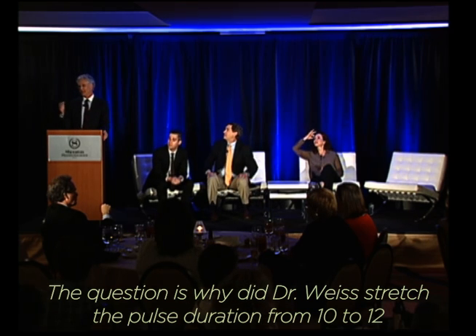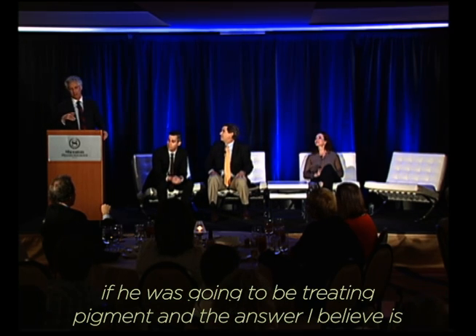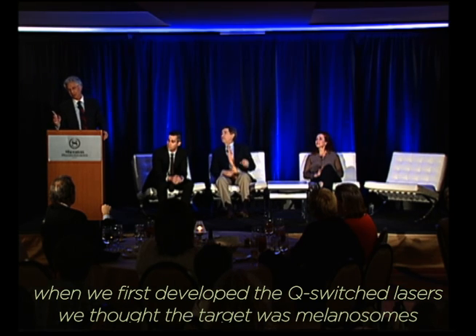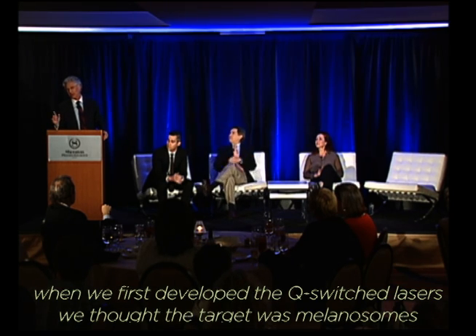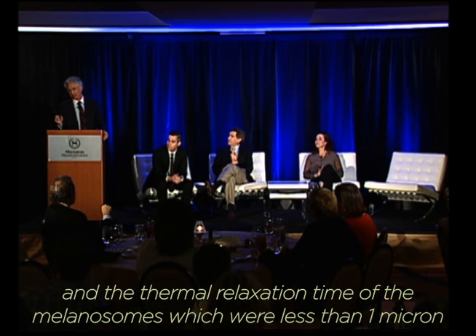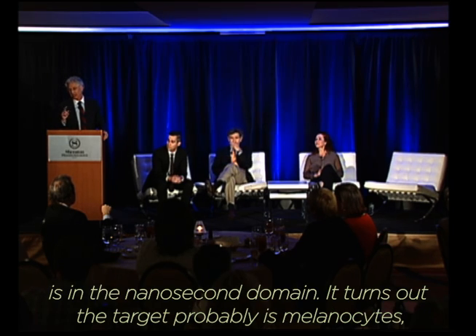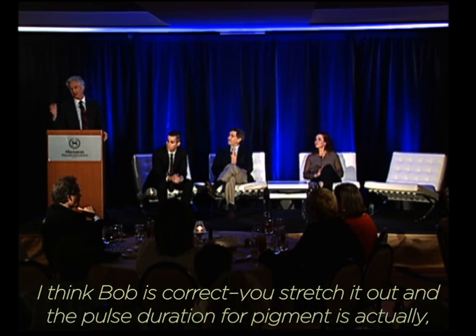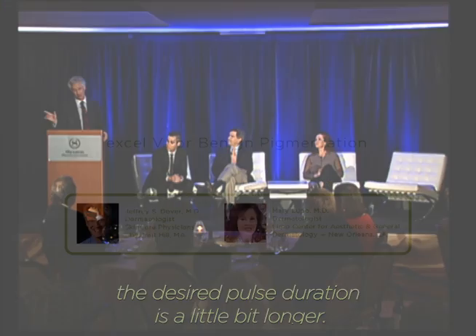The question is, why did Dr. Weiss stretch the pulse duration from 10 to 12 if he was treating pigment? And the answer, I believe, is when we first developed the Q-switch lasers, we thought the target was melanosomes. And the thermal relaxation time of melanosomes, which are less than 1 micron, is in the nanosecond domain. It turns out the target probably is melanocytes, which are much bigger, for which the thermal relaxation time is in the millisecond domain. And I think Bob's correct. You stretch it out. The desired pulse duration for pigment is a little bit longer.